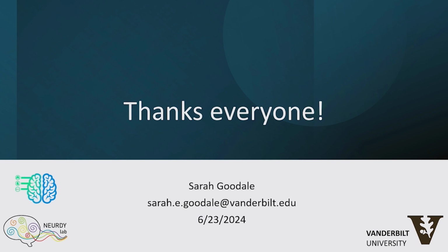And what about post-hoc? After the acquisition, what would be the main things you're looking for to say if the data is good or bad? Yes, post-hoc, if you are looking at the data after you've collected it, make sure that you see really nice waveforms in the PPG signal, really good peaks. Respiratory-wise, you're again looking for those sinusoid signals.